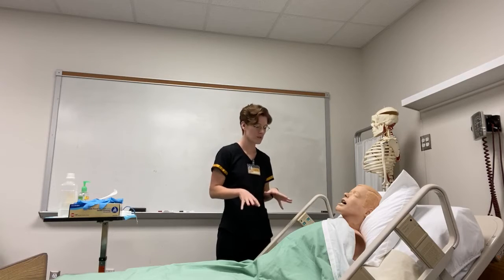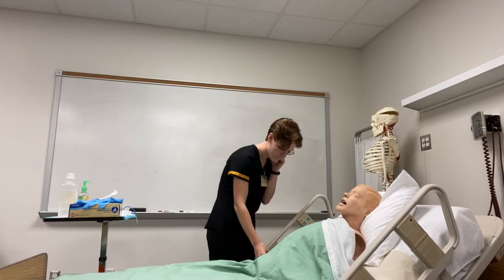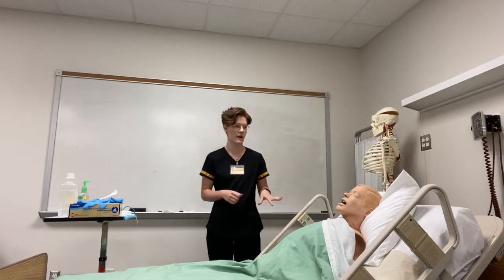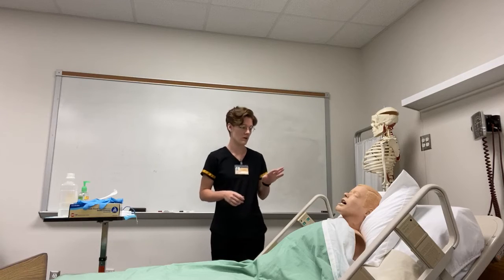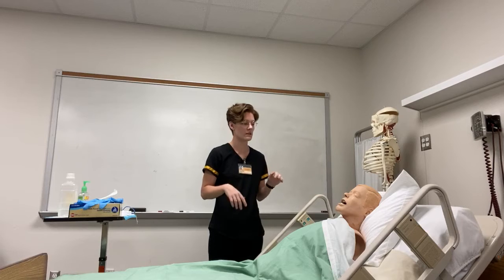So first, before I start, can you please state your name and date of birth for me? Amanda Dr. 4799. Alright, and that matches with my EMR, and the order matches for the patient as well, so I can continue. And do you have any allergies? No. Are you experiencing any pain today? No, I'm fine. Okay. And how's your breathing through your nostrils? Is there one that is better than the other? No, they're both pretty good.